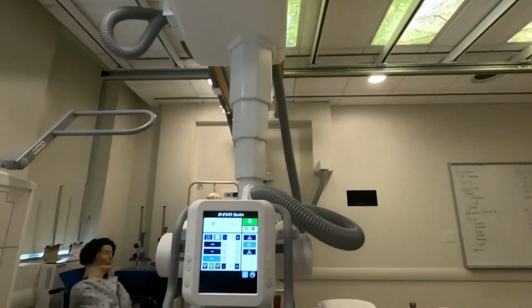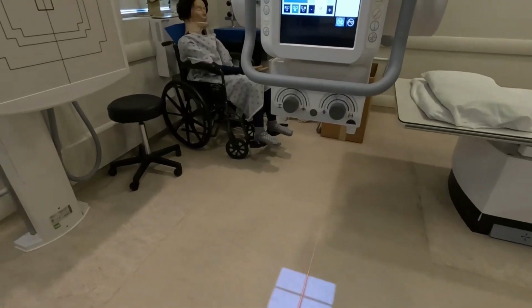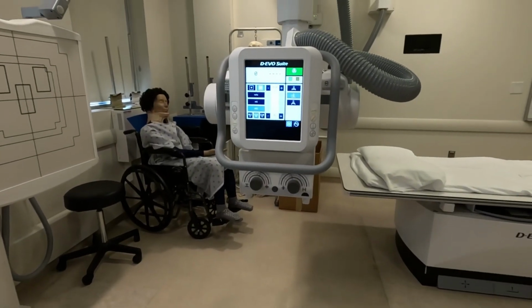Now we're going to look back at our x-ray tube, and our x-ray tube is shooting directly at the floor. So we can't shoot a chest x-ray in our wall bucky because we're shooting at the floor. So common sense would say you've got to do something else.